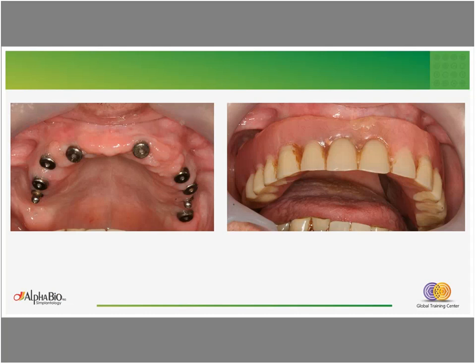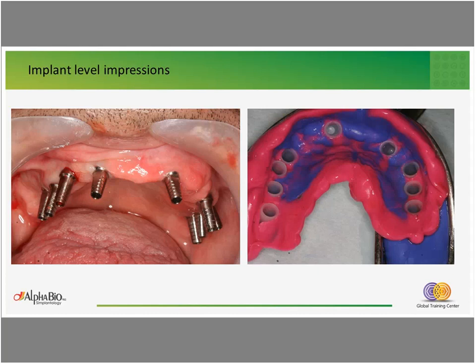You can see that we have a connected special abutment for impression taking, using the snap technique in order to make it easy to take the impression. And after we have the final working model, we have a setup of teeth. According to the setup of teeth, we have to correct the angulation of the screw-retained restoration.